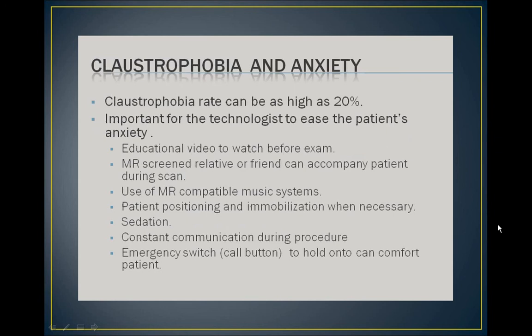In all cases of claustrophobia, just talking regularly to the patient can be the most helpful when comforting them and getting them through their procedure. For example, patients like to hear, "This next sequence is about 4.5 minutes. I'll talk to you as soon as it's done." Or, "The next scan is 5 minutes. You're doing a great job." Or, "We're only halfway done." Or, "Only 15 more minutes to go. Keep holding still." This human contact over the intercom can be the only thing that gets them through the test, and it is our job as MRI technologists to keep constant contact with the patient.